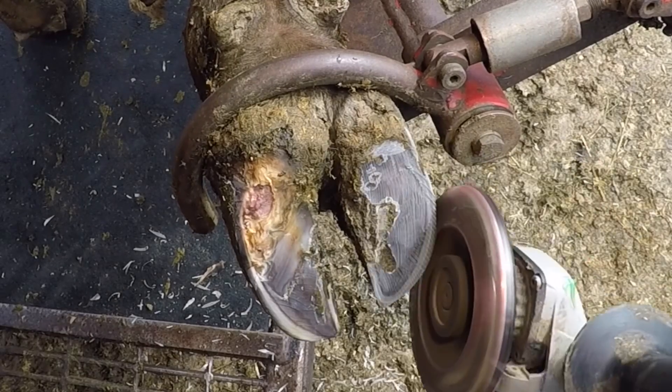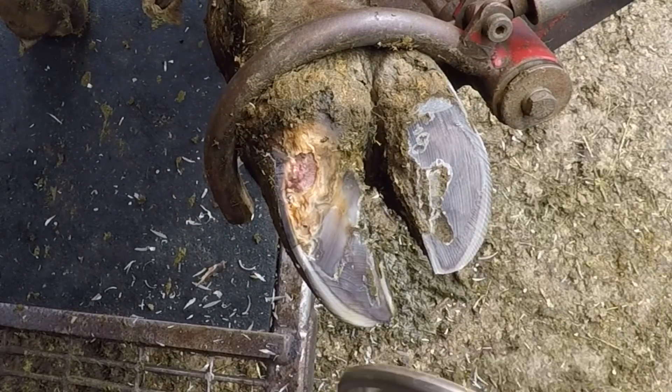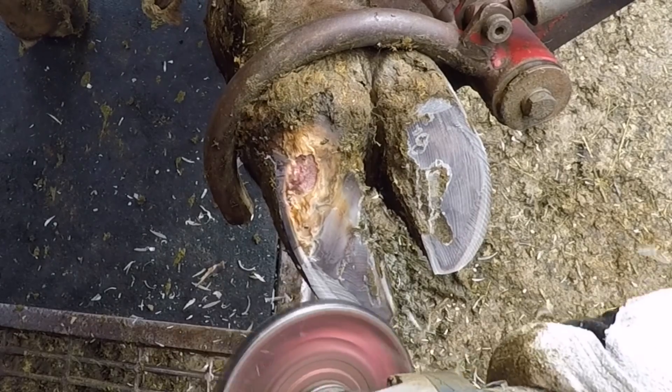Here I'm prepping the other claw to apply a block to it. While that adhesive is setting up on this block, I'm going to finish cleaning up that wound from the other side.